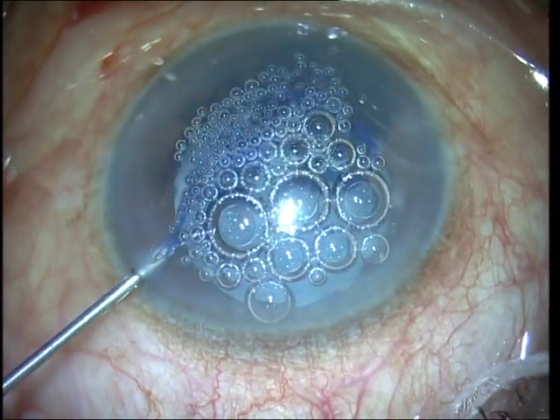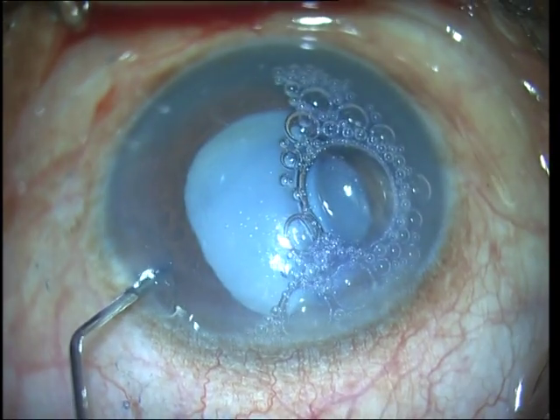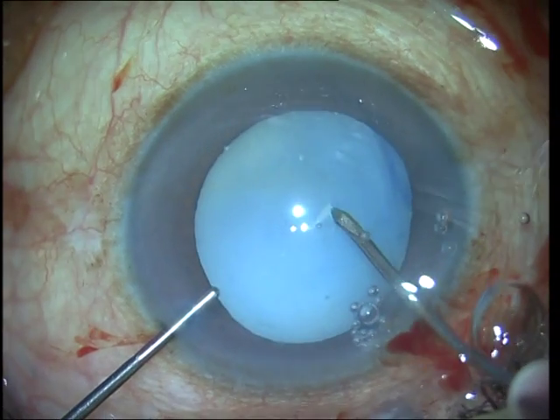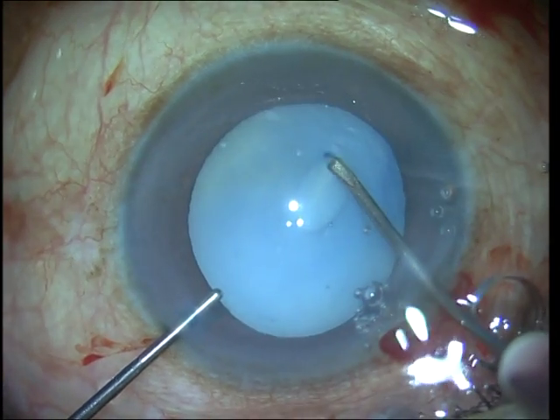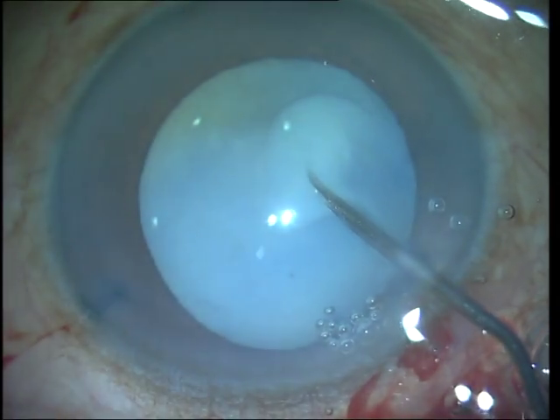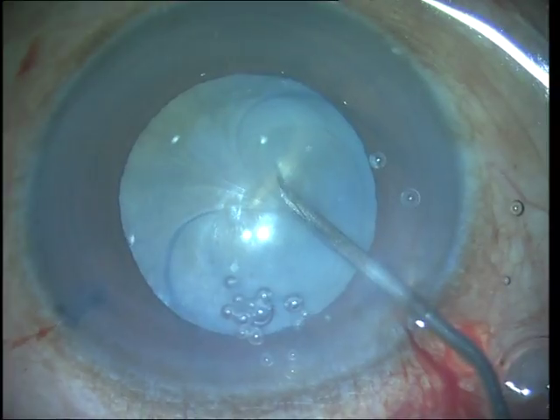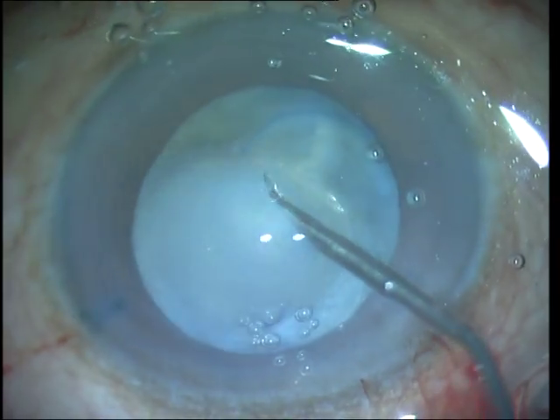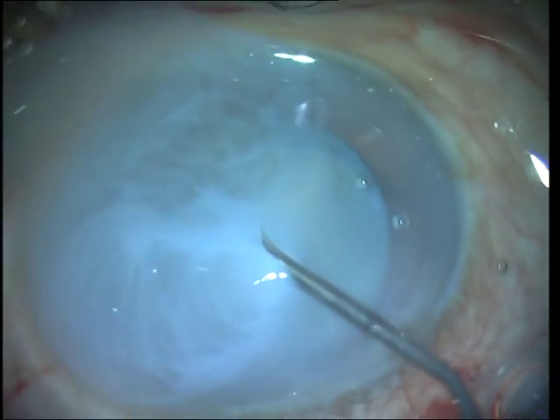You can see that I first go in and inject trypan blue to stain the capsule, and then replace the trypan blue with viscoelastic. As soon as I make that entry into the capsule, you can see that milky fluid that comes out. What we do here is to decompress the eye before performing the rhexis further by aspirating part of that milky fluid out of the capsular bag.